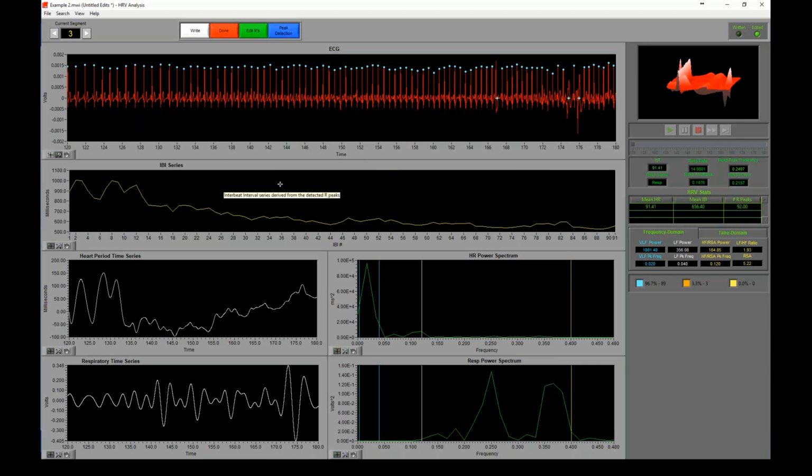And from there, we want to pull out frequencies from that waveform. So you can think of a frequency as a sine wave, if you're familiar with that type of waveform. A sine wave is a signal that has a pure frequency. It's only a single frequency.